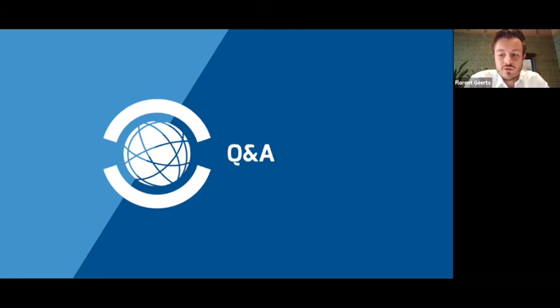And Dr. Ngok An is right, that's indeed fixed at 60 in the end. We've recently also, in support of the team in Vietnam, written a guide about this, because this is something that people can also change in the backend. So if you're changing the threshold for your program to, let's say, 50, for example, or even higher or lower, then people can now change that in the backend of the software themselves as well. So I hope that answers the question that was raised by Linda.